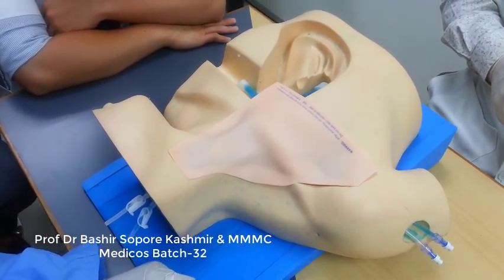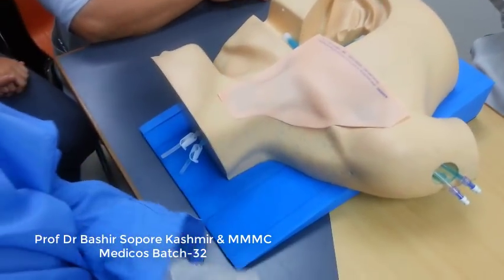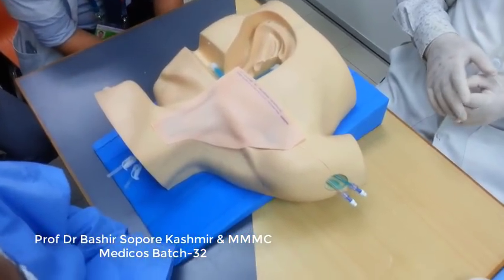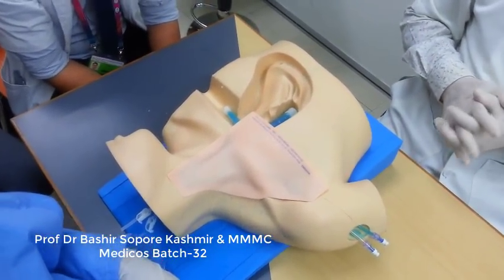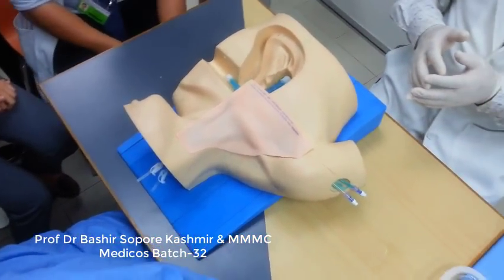Which is the first needle you will insert? The finest, the thinnest needle, the 25 gauge needle. These are the needles here. Before that, you have to clean the area. Now you know where the area to be cleaned is.